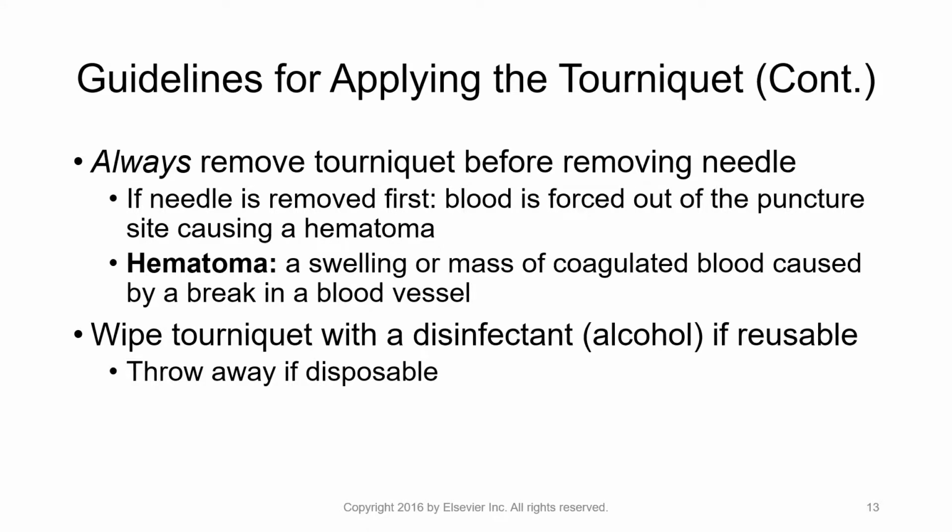Remove the tourniquet before you remove the needle. Even in an emergency, it's a must do, and this is why we use a quick release application of the tourniquet. So we just need one hand to release the tourniquet. If your tourniquet's reusable, disinfect it, or just throw it away.